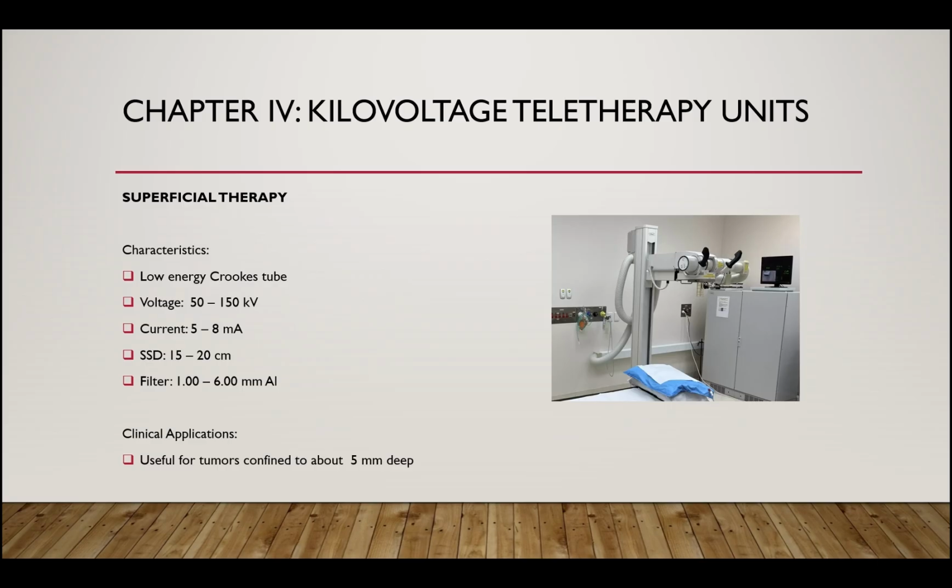So the superficial therapy is useful for tumors confined to about 5 millimeter deep. So beyond this depth, tandaan natin na kapag lumagpas na siya sa 5 millimeter depth, the dose is too severe to deliver adequate dose without considerable overdosing of the skin surface.